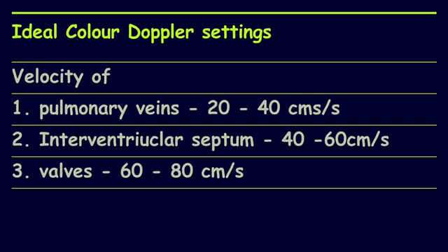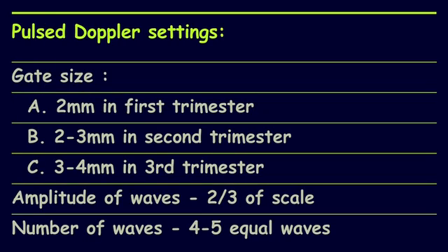Technically, this is achieved by adjusting the PRF. When using pulse wave Doppler, it is important to adjust three parameters: gate size, amplitude of waves, and number of waves. Keep the gate size as 2 mm in the first trimester, 2–3 mm in the second trimester, and 3–4 mm in the third trimester. Adjust the PRF such that the peak of the wave occupies two-thirds of the scale, and ensure that at least four to five equal waves occupy the frame. This is the optimal method for using pulse wave Doppler.